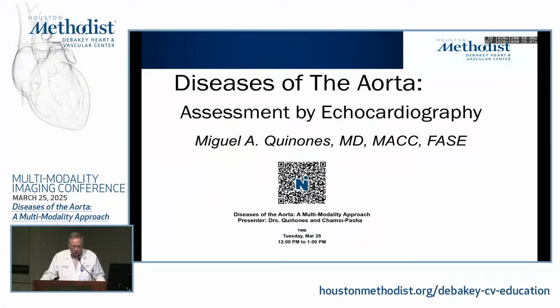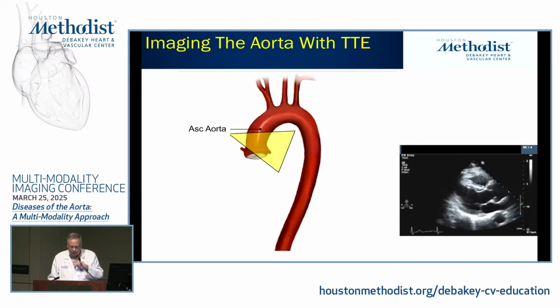That was an outstanding talk, and you all can see now why CT and CMR truly have taken the front stage for evaluation of the aorta. However, ultrasound echocardiography still plays a role in several areas, which I'm going to point out.